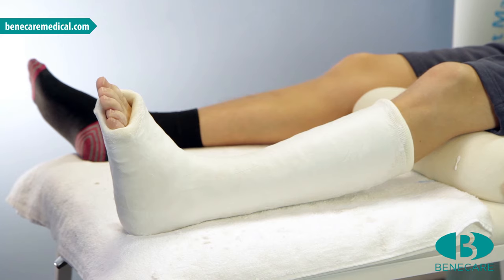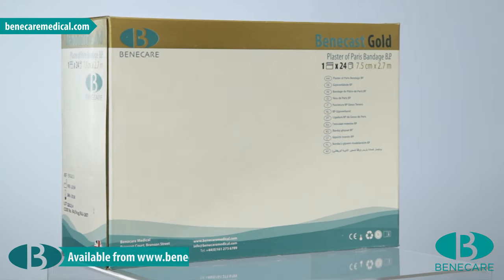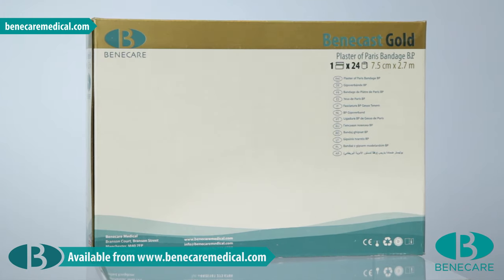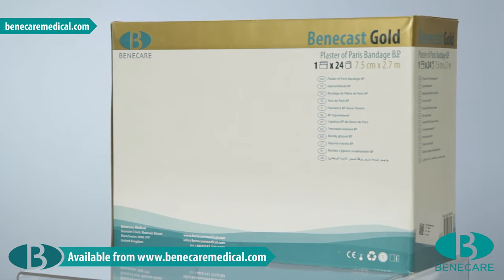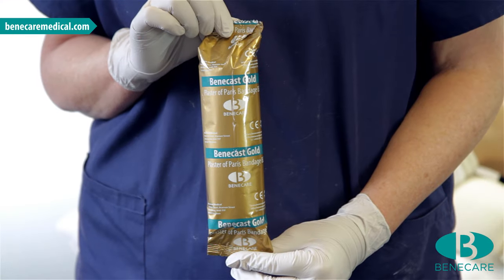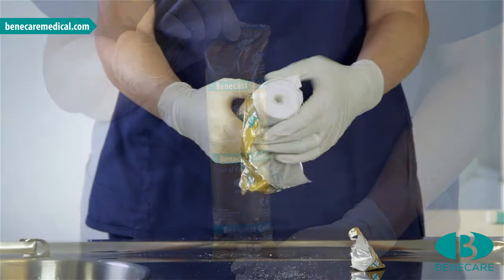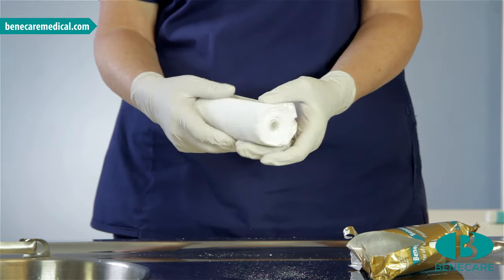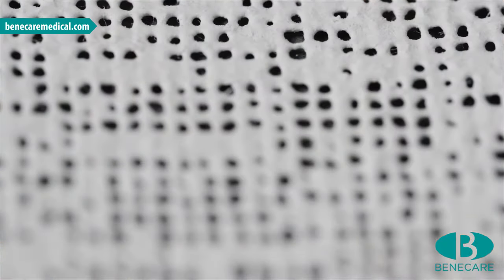Today, I am applying a below knee cast made of Benecast POP Gold. This is suitable for all ankle and foot indications. However, in addition to emergency treatment such as the application of backslabs, POP is often used for indications that require a very close moulding such as displaced fractures, talipes, or total contact casting for the treatment of diabetic foot ulcers.